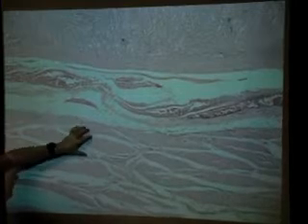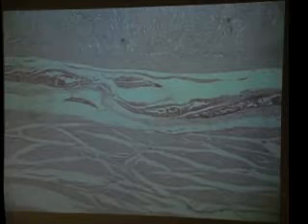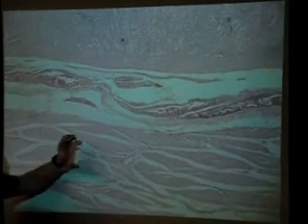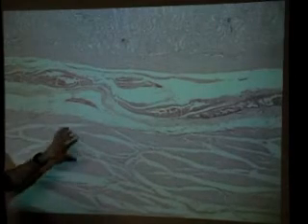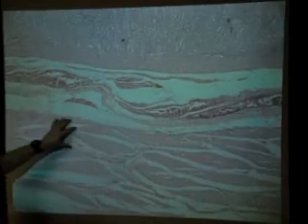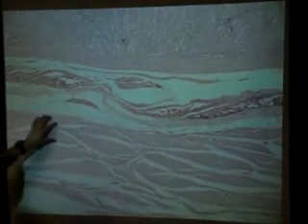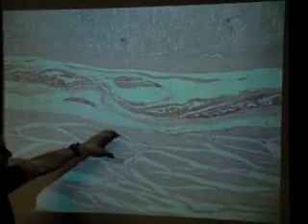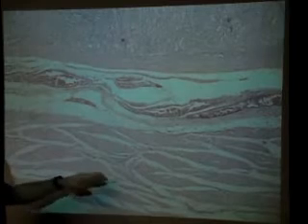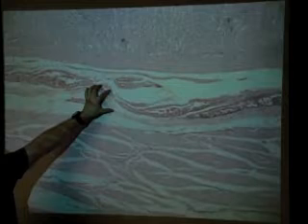The layer below that is the muscularis layer. That is the muscularis externa down here, and this has three parts on the stomach. The very top layer of the muscularis externa is the oblique layer. So this is the oblique layer. Now there's nothing that really identifies it separately from the next layer, which is the circular layer, other than the oblique layer is right next to the submucosa.